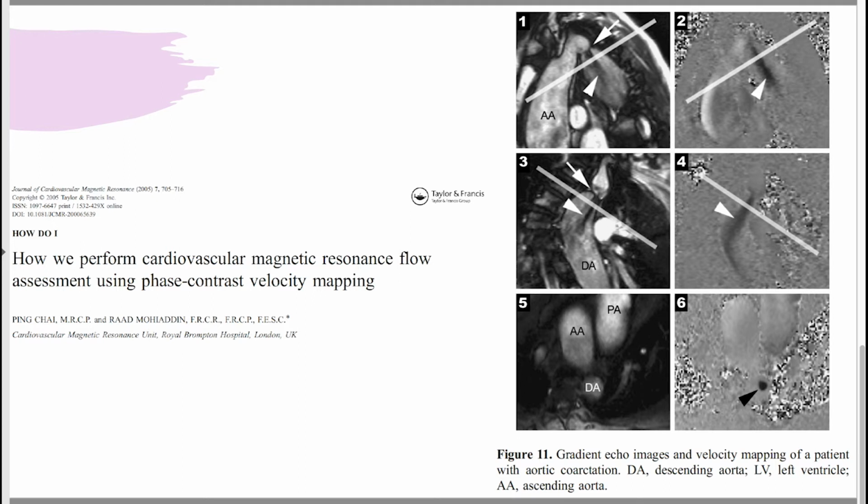Blood flow across the stenosis is recognised with cines, and these are then used to position the planes required for velocity mapping CMR. Flow velocity mapping techniques across the coarctation measure blood flow velocity and a pressure gradient then estimated using the modified Bernoulli formula. Flow velocities may normalise in significant coarctation with extensive collateralization.